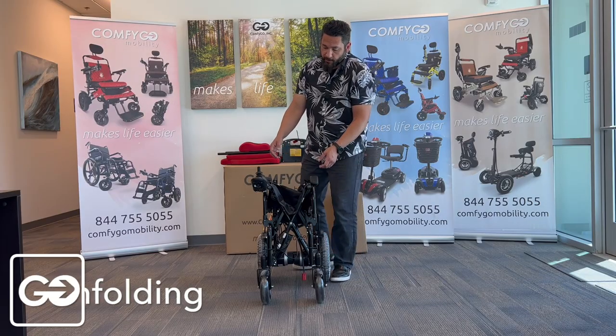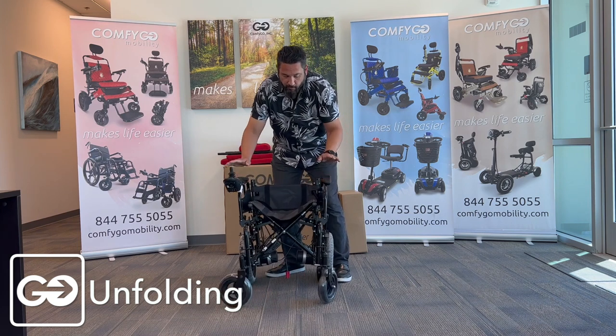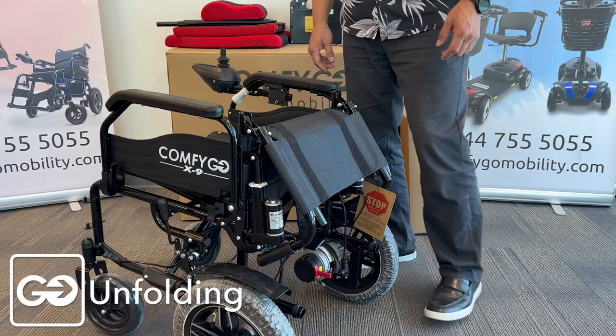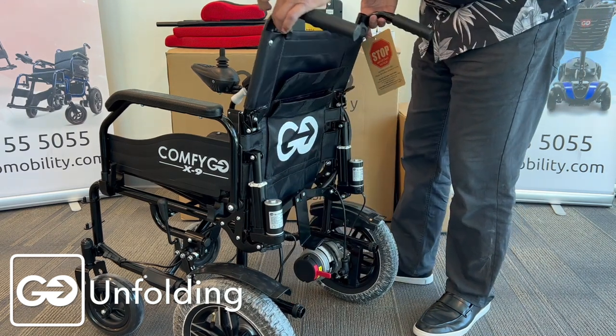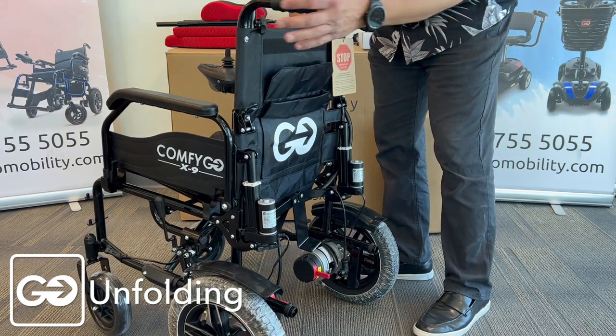Now that we have our controller in place, we're going to unfold the chair by simply pulling the armrests apart. Pull them apart, get your hands, press them down, and feel them snapping or locking in place. After we unfold our wheelchair, we're going to take our two bars on the back and lift these up — they're going to lift up pretty easily and just snap into place. You're going to hear a snap on each one.